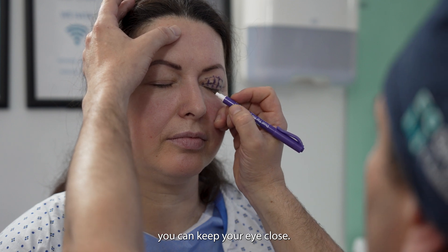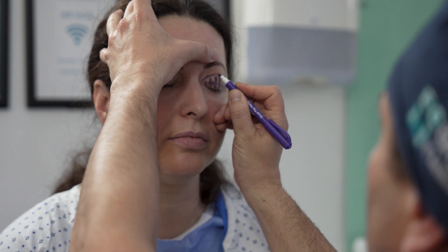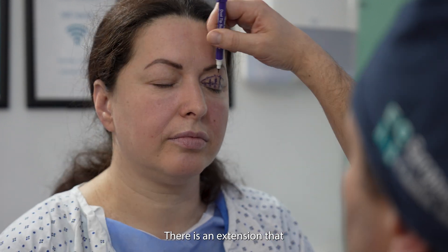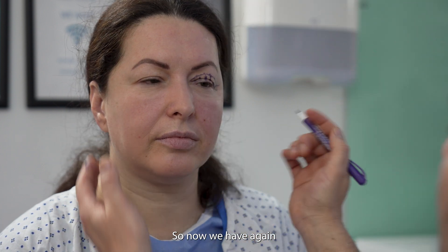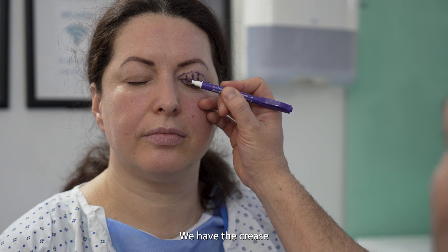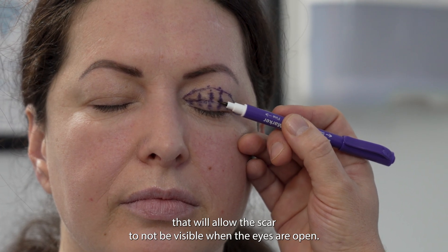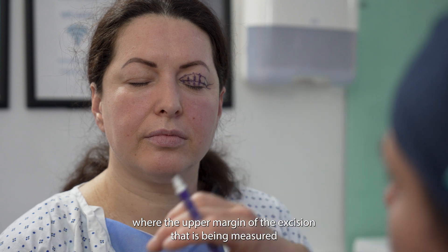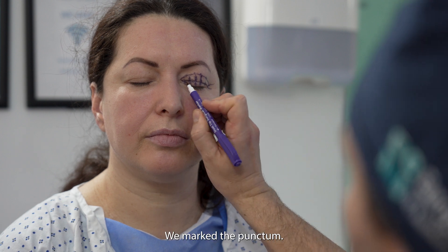And towards the inner canthus now — keep your eye closed. There is an extension that goes towards the nose that is essential to be removed. We have the crease that will allow the scar to not be visible when the eyes are open, and that represents the bottom edge of the excision. We have the upper margin of the excision measured with the pinch test, and we have the extension into the top line. We also marked the punctum.